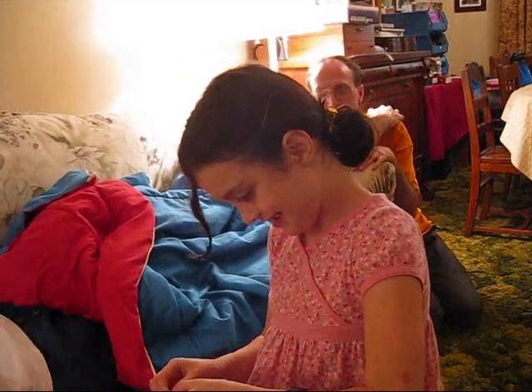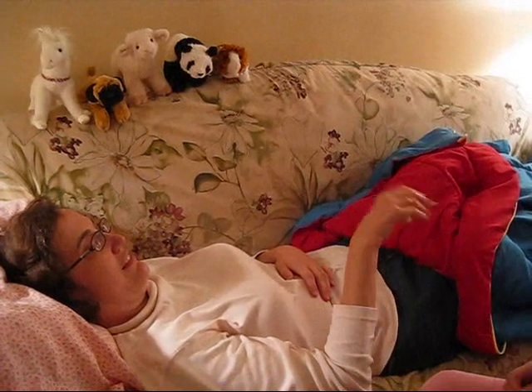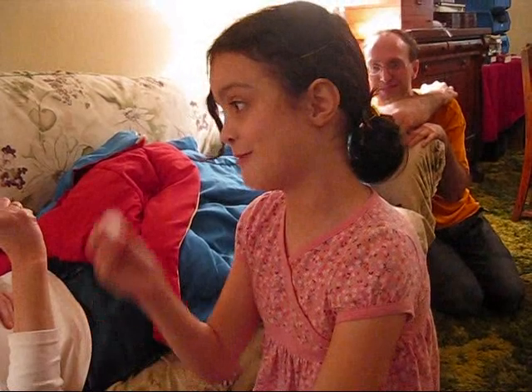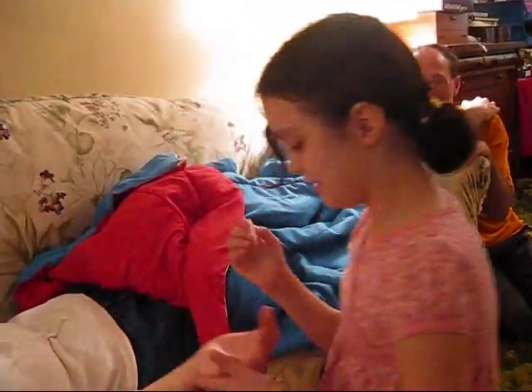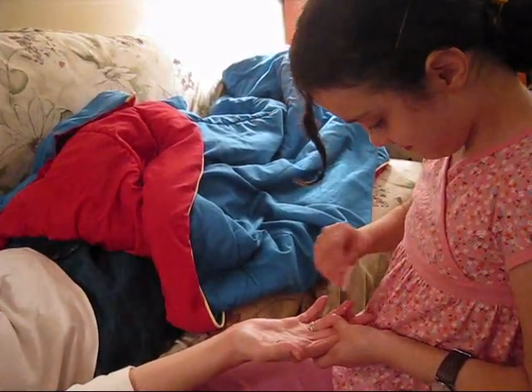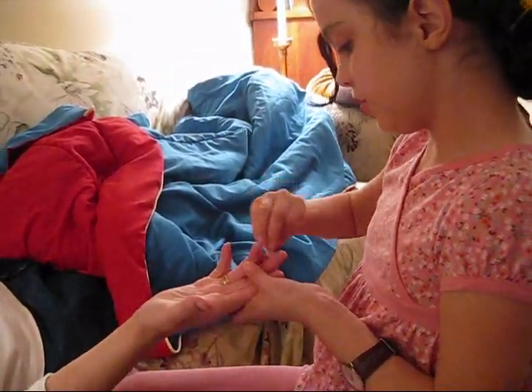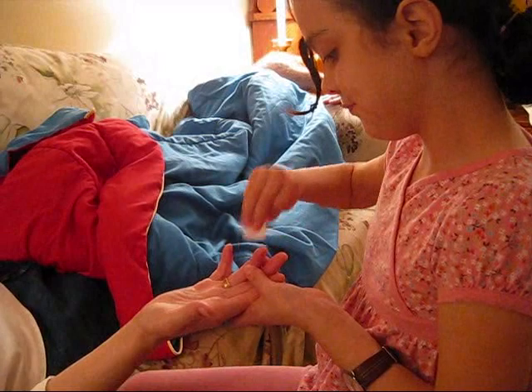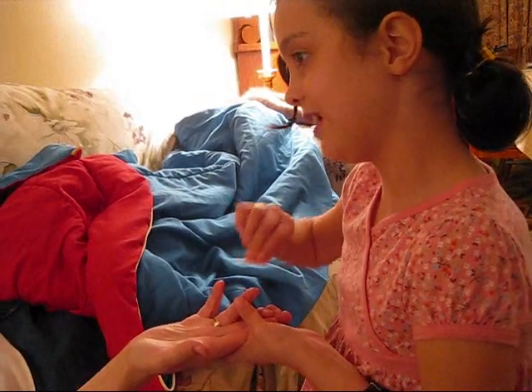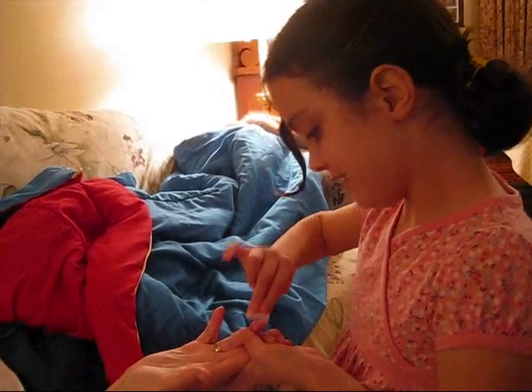Just let me know when you want my hand. I'm going to have to go open the stuff. It smells really bad. Which one? How about that one? We need to get it very clean so we won't get any infections or anything. I don't want any kind of infection — any germs or something. That would not be good.